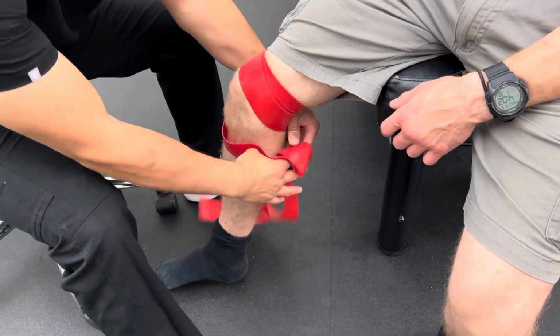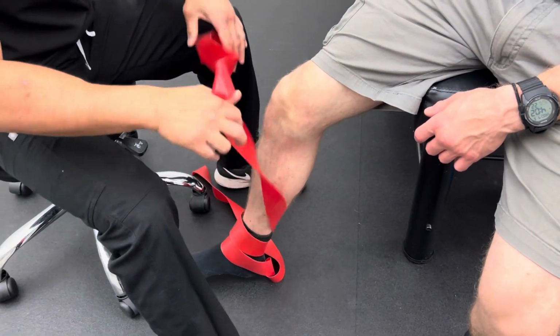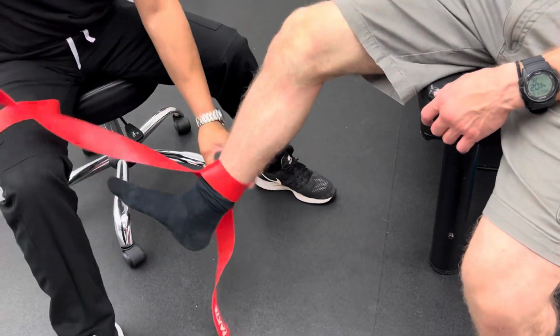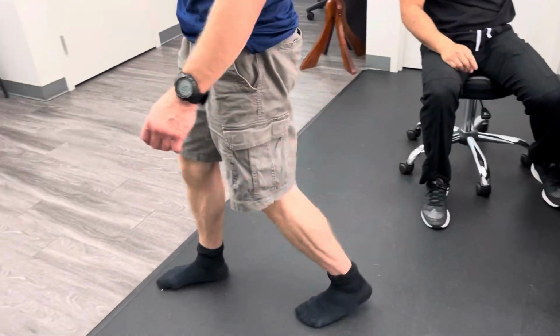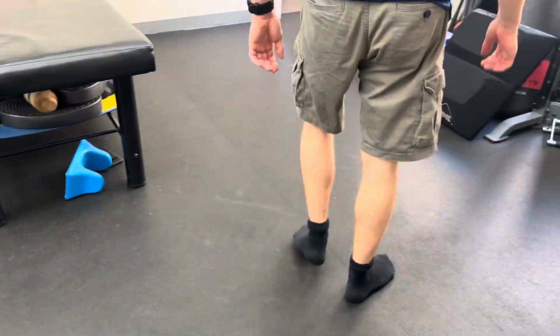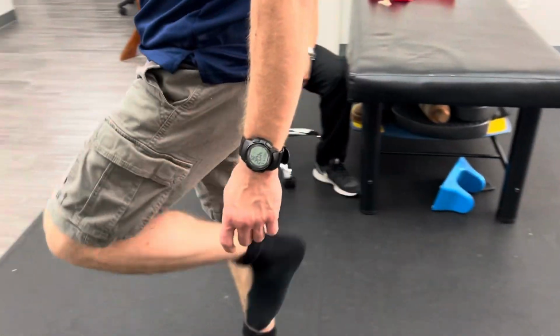And a lot of times, instead of necessarily doing a lot of myofascial or manual therapy work, this is exactly what we would do. Okay, stand up, walk around, see how it feels. Feels pretty loose right now? It's definitely loose, even looser than the other leg. Okay, good. All right, good.